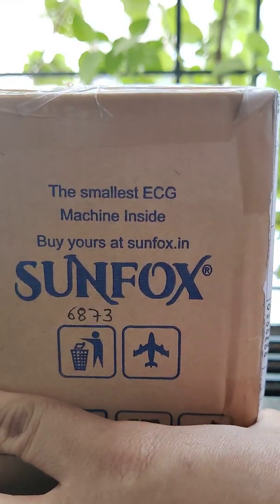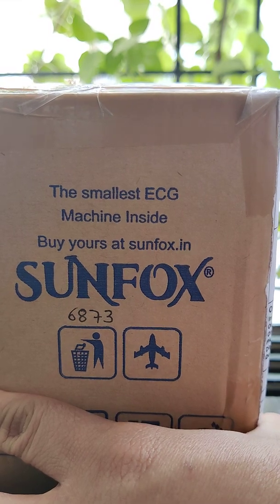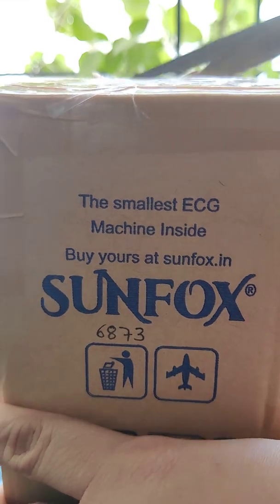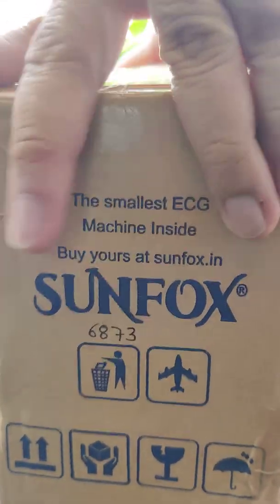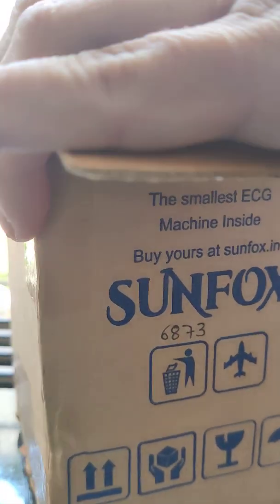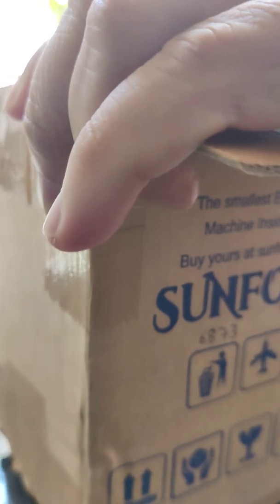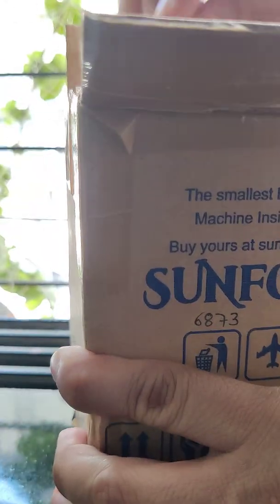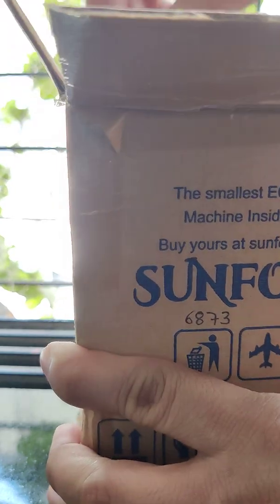So let's quickly unbox this and see what's inside the box. They have shipped this device all the way from their hometown, which I think is Dehradun, all the way to Mumbai where I live. So let's pull out what's inside the box.